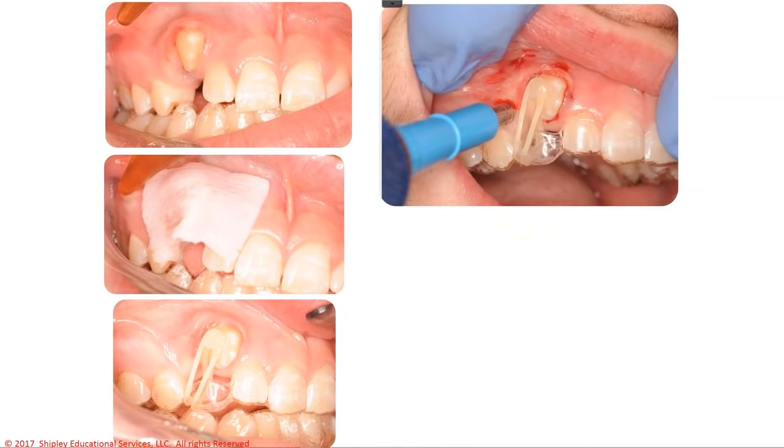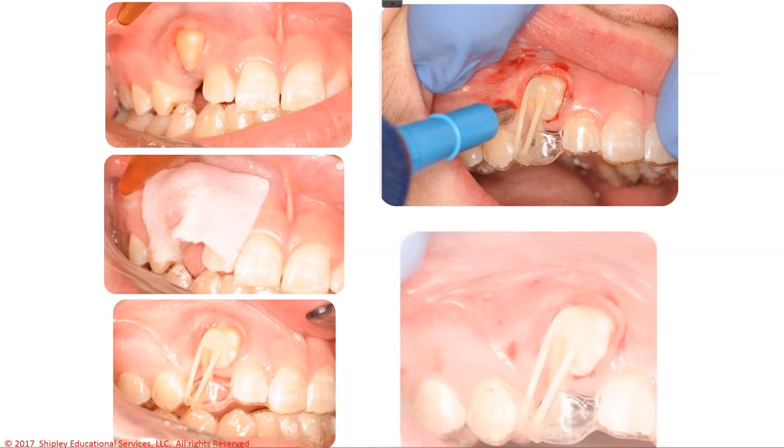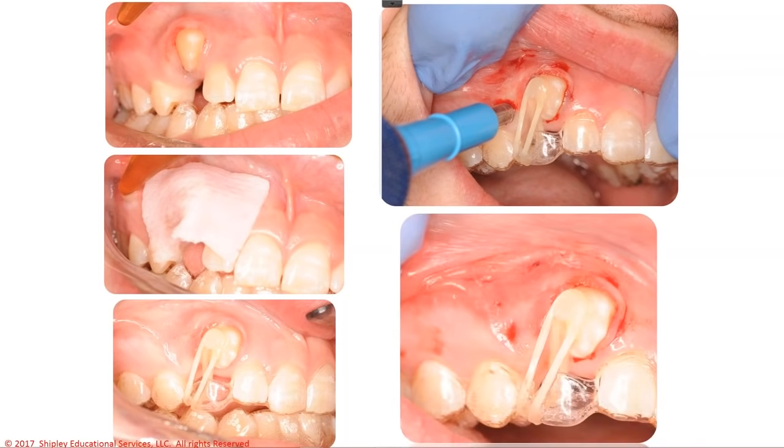You can see in this slide, this is my first propel, but you can see the tissue is kind of raw. That's because they left the topical on too long and we get what's called tissue sloughing. The topical was probably left on 5 or 6 minutes. We don't want to leave it on that long. We want to make sure we set a timer and remove it after 3 minutes so we don't get that sloughing. And then we do the propel around that tooth.